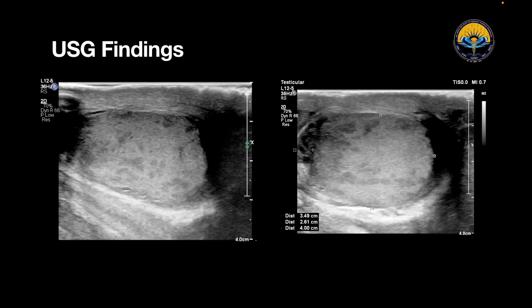My case is a 60-year-old male who came to surgery OPD with chief complaints of testicular pain since 7 days. There is no issue of testicular trauma. The patient was referred by the surgery department for radiological investigations, and we did a USG scan. Here we see that there are multiple hypoechoic lesions seen on both the testes.